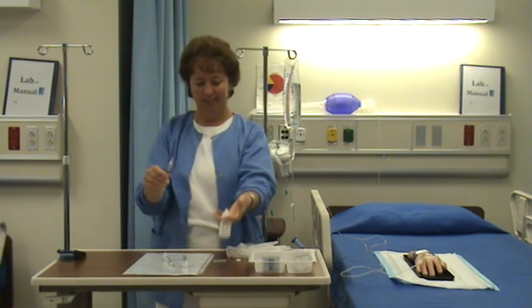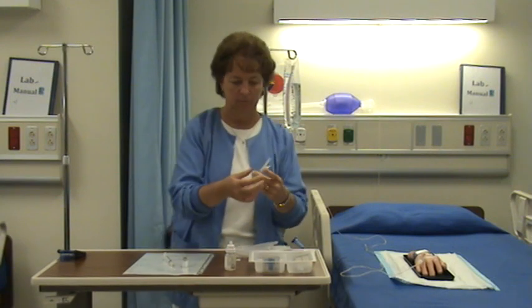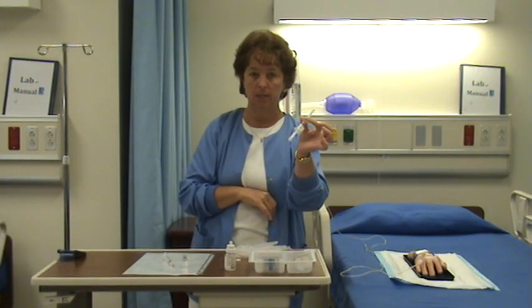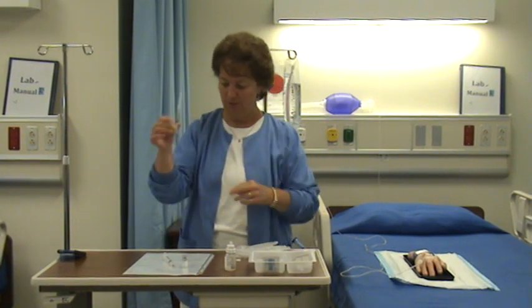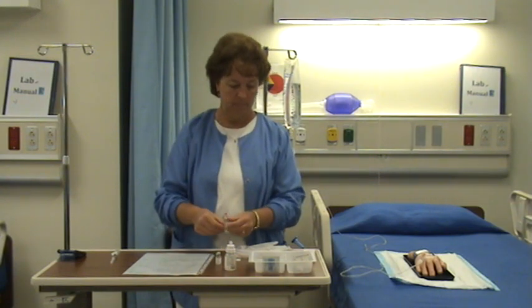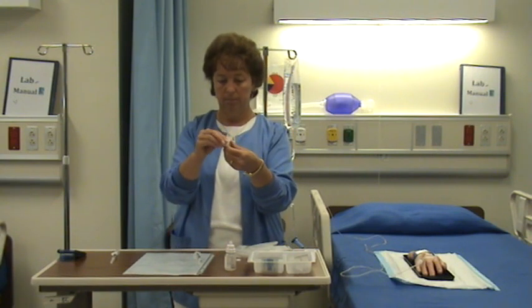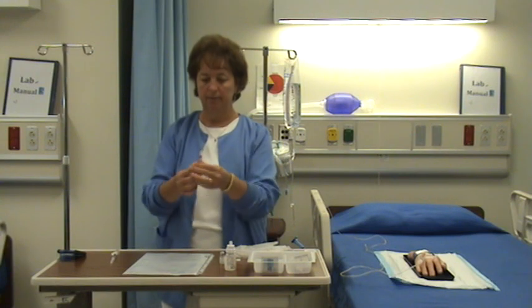So here's my 2 milliliters of saline, and I've marked it, so I know what I got in that syringe. Really important when you start doing IV push medication, because which is the saline, which is the Lasix, that can get confusing. So I got my saline, and now I'm going to draw up my Lasix. Take another alcohol swab, and I'm going to clean the top of that. And I have a needle.